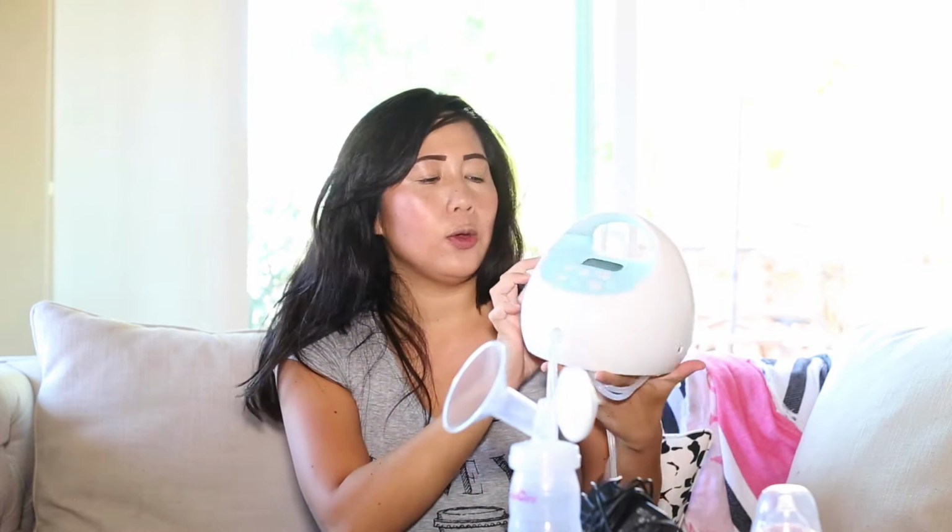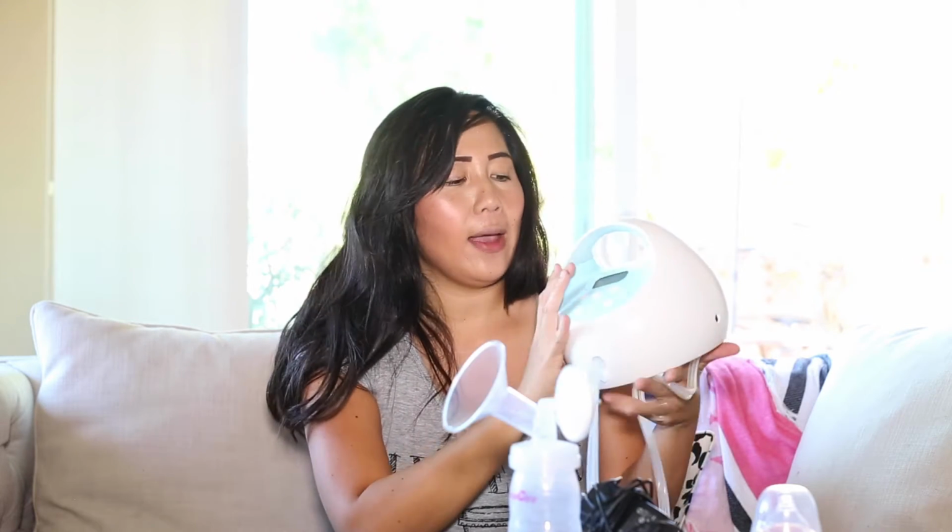A couple things about this here. You have these buttons right here, a power button, then a cycle button, a vacuum button, and a night light button. A few things about these features. I really don't know what the cycle button does. I actually think that I can't feel the difference with it. I stay on cycle 38, and it works fine for me. That's the default cycle, I think.